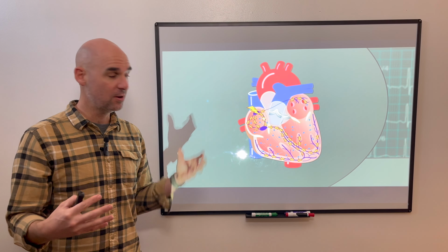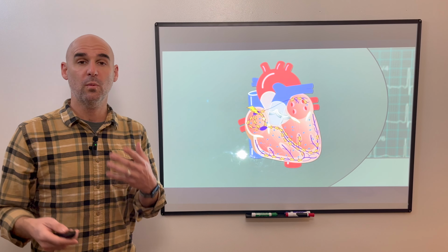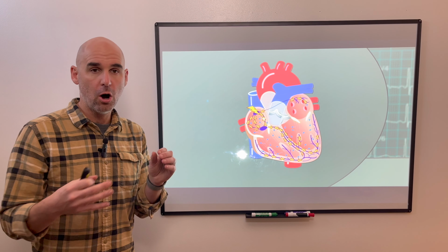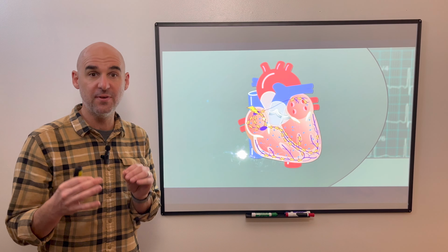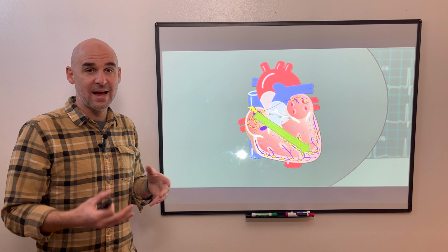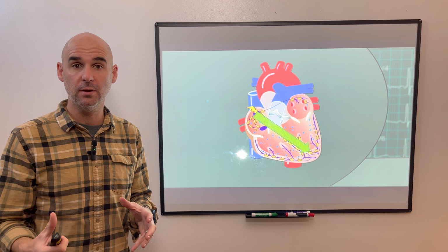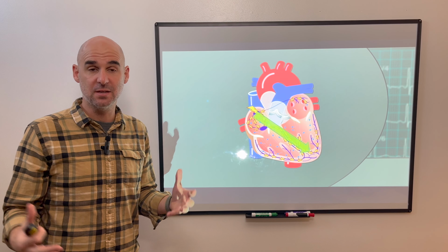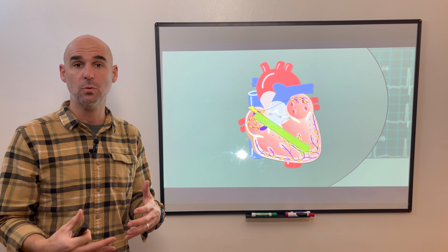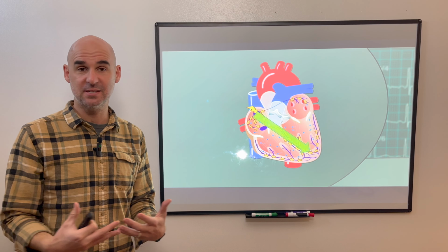And that's fine and good as it does that and it all depolarizes, okay? But what axis tells us is actually, it doesn't care. Axis isn't about what all those little cells are individually doing. It's looking at the collective. And what we're looking for is actually the average direction of that depolarization within the heart, okay? That's all that axis is. It's the average direction or the mean direction of the depolarization wave throughout the heart, okay? That's it. That's simply all it is.